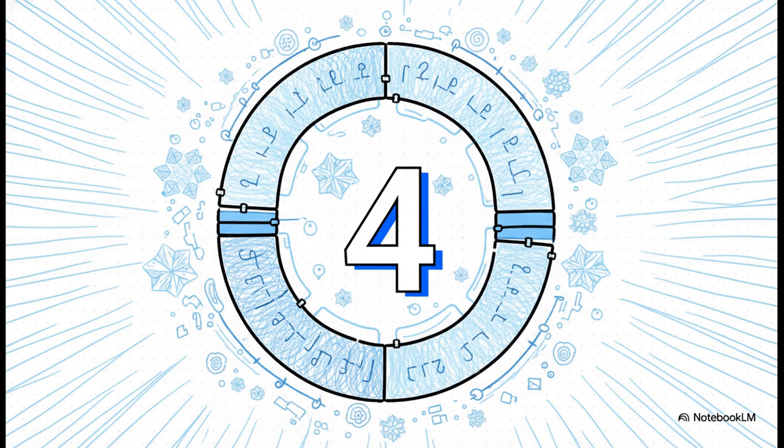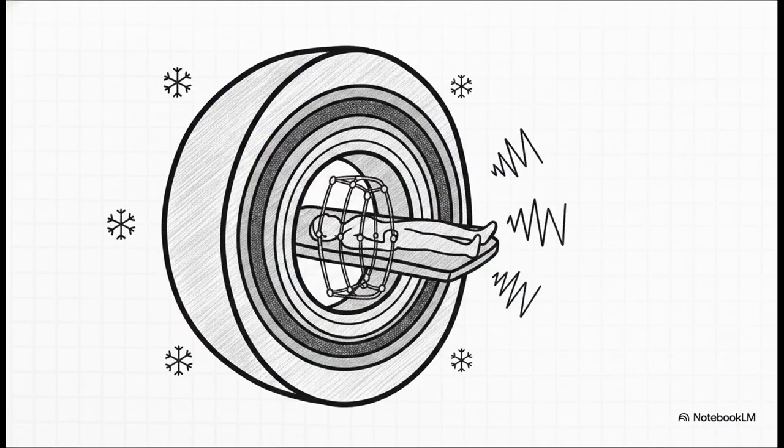This B0 magnet is typically a massive solenoid made of niobium titanium filament. By cooling it all the way down to 4 Kelvin, the metal becomes completely superconducting. That means it can maintain that massive magnetic field indefinitely, with absolutely zero electrical resistance. The real engineering marvel is how all these extreme components work together in total unison. We have the superconducting main magnet generating that massive B0 field.